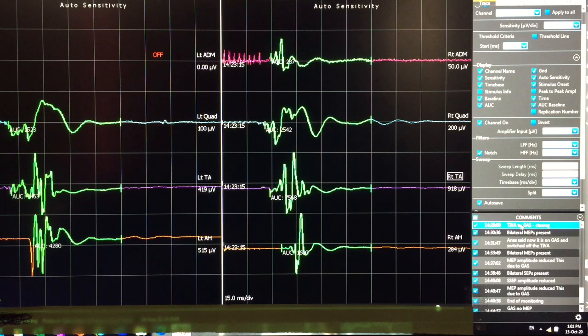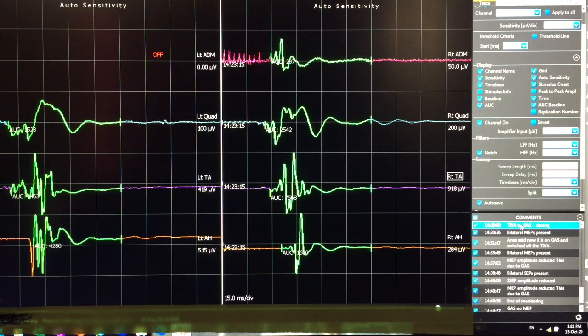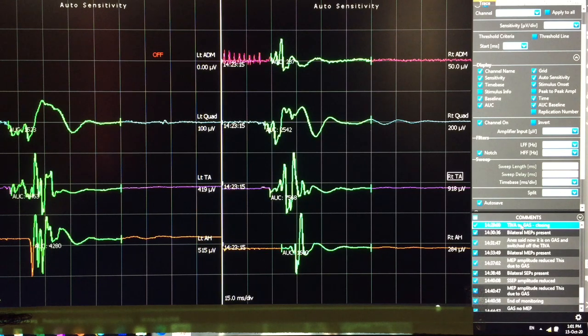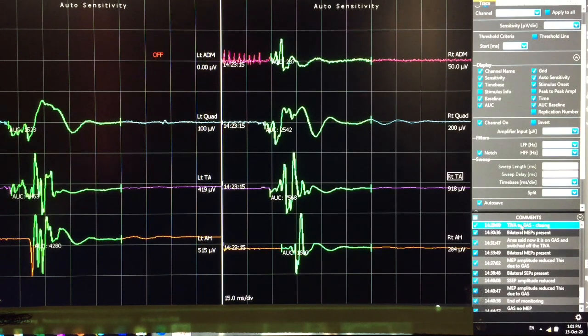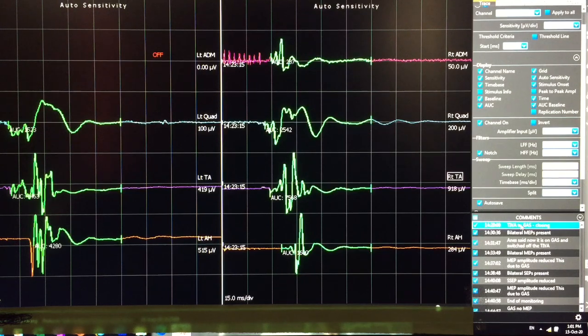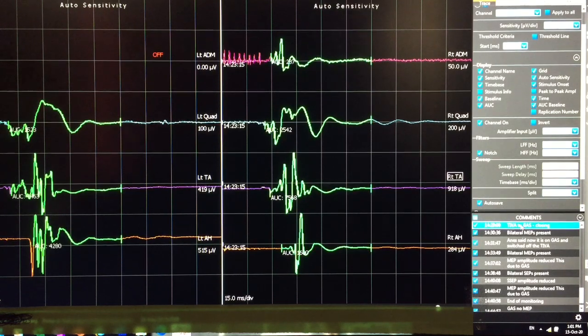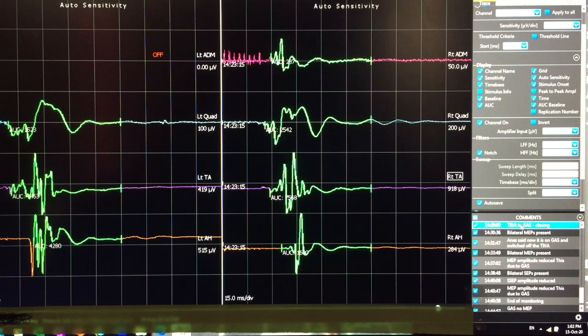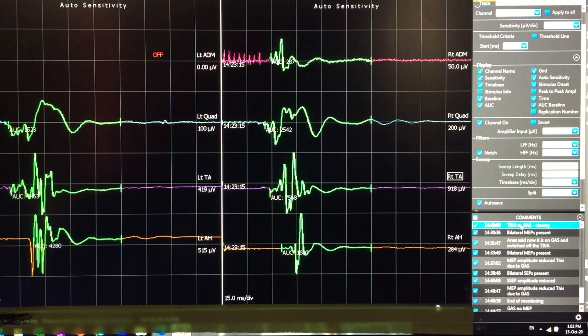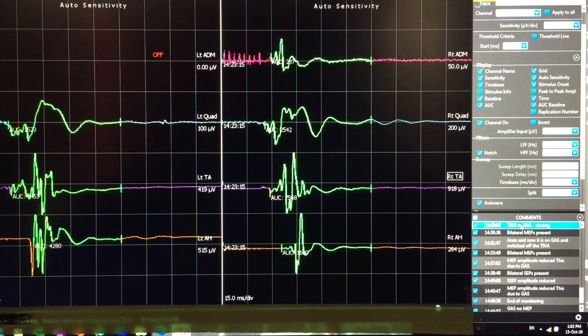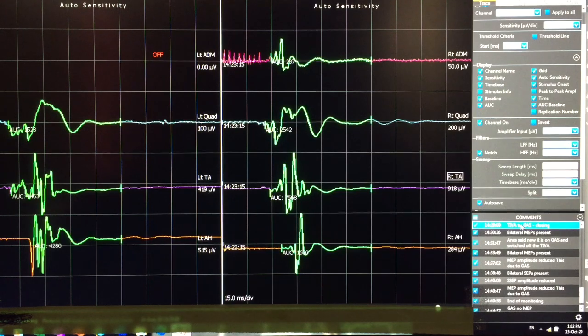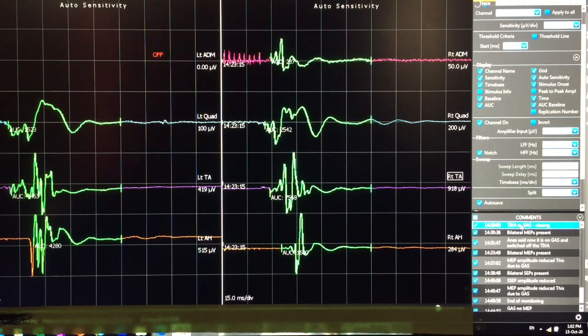I made this video because of the request from one of the anesthetists. In this screen, you can see very good MEP responses with very good amplitude. This is before switching off the TIVA and putting the patient on gas inhalation anesthesia.